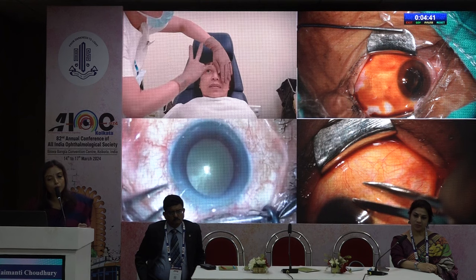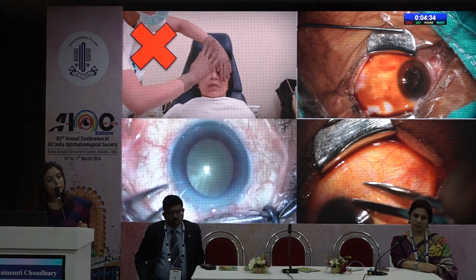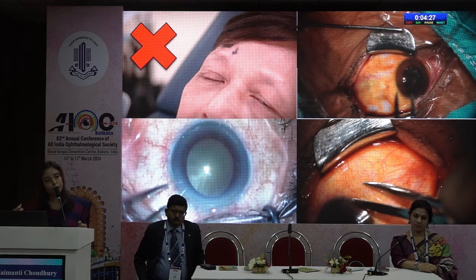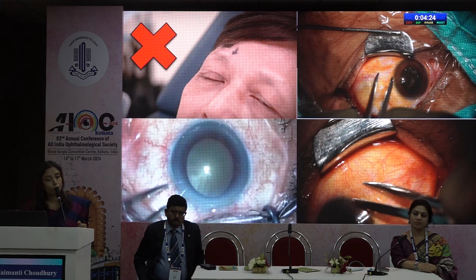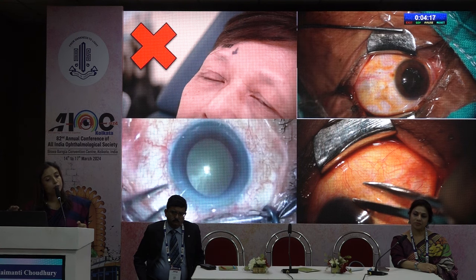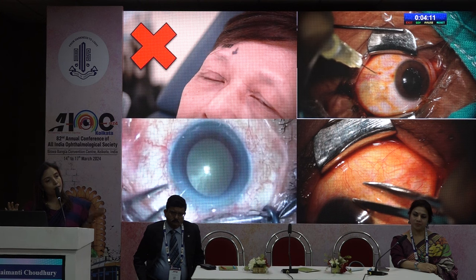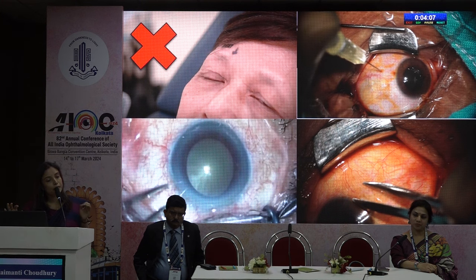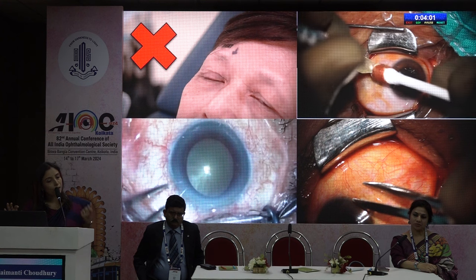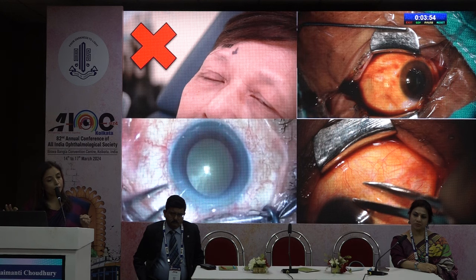Coming to another mistake video, you will note a staff nurse has just injected this lady. But in India, it has to be done by a trained ophthalmologist. Again, our preferred quadrant is inferotemporal, but it can be any quadrant of your choice. After putting 5% povidone iodine, we are marking with the caliper. It will be 3.5 to 4 millimeters depending on the lens status. After it has been marked with the caliper, again one drop of 5% povidone has to come in. Then a brand new 30 gauge needle is used. It is certainly not the needle with which you had taken out the drug. And then this is plugged with a cotton, and then again 5% povidone is given.